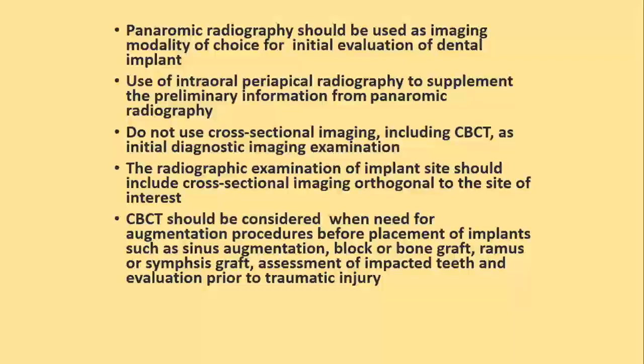Is this patient who's diabetic, is the bone around okay? Because you know of this thing called a wandering abscess in diabetes, where the periodontal tissues are compromised every other day. One day the maxilla, the other day the mandible. You'll just wonder, hey, what's wrong? The bone looked great today. Then you place an implant, and a couple of months or years down the line, it fails. Nothing wrong with the CBCT, it was fine that day. It was about your planning. And that plan should start with a PAN because it's going to give you the status of the periodontium.